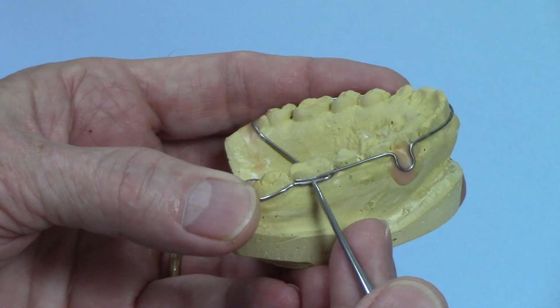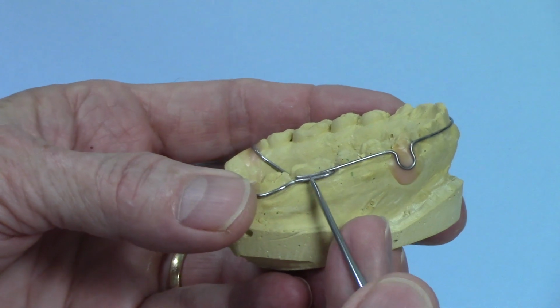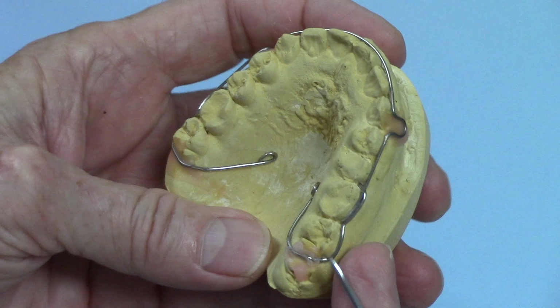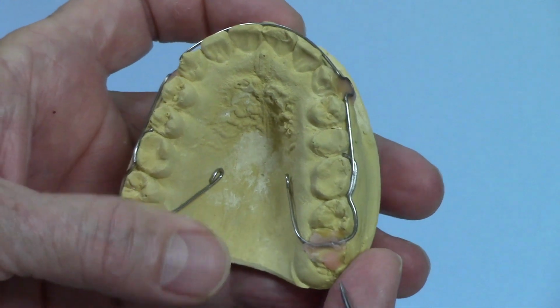Now if you have a laser welder or a puck, this would be a great thing to use it on. I don't have that, so I'm going to be soldering, and that has to be a really good solder joint so it doesn't break down. So when you wear this, because this is a spring hard tempered wire, it's going to be very rigid. It's going to hold this wire into place.